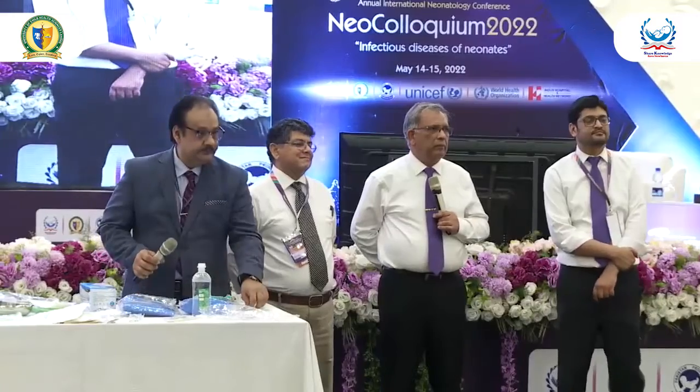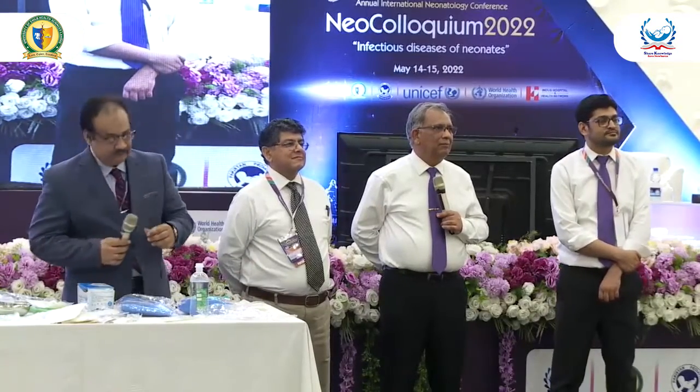So my question is, is Portacath more convenient than the PICC line in children for the safety rules? Is the Portacath more convenient? We are talking about neonatology, newborns. Portacath is not feasible. Portacaths are for bigger patients.